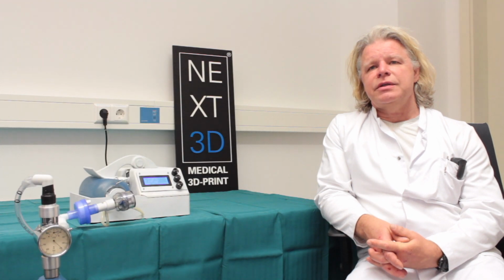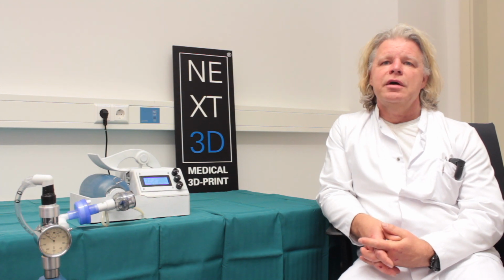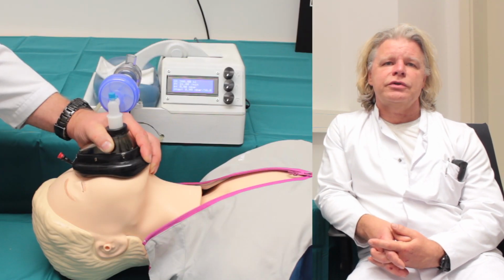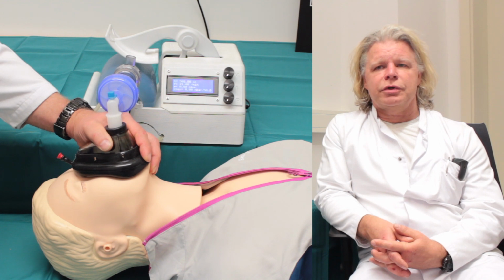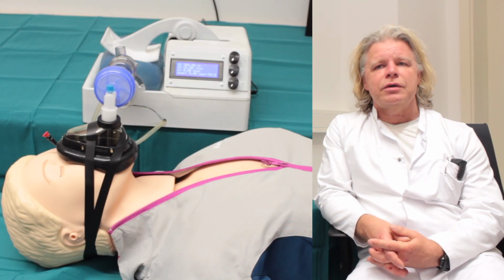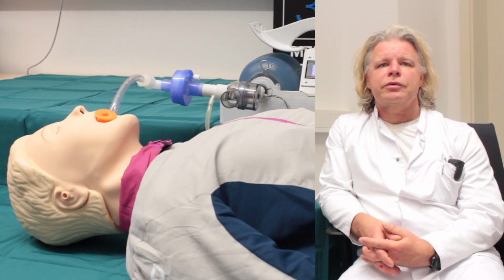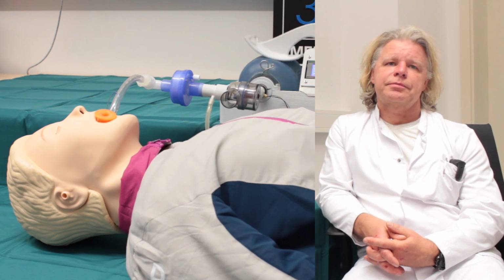The ventilator is intended for ventilation with room air that can be enriched with oxygen. This corresponds to the increased oxygen requirements and the restricted oxygen exchange via the capillary network of the lungs.